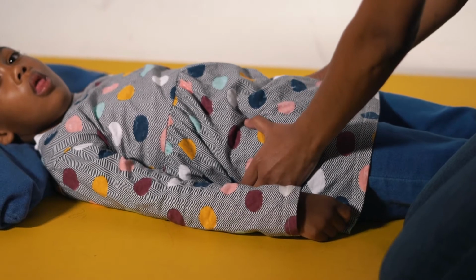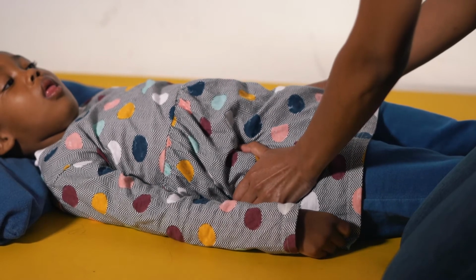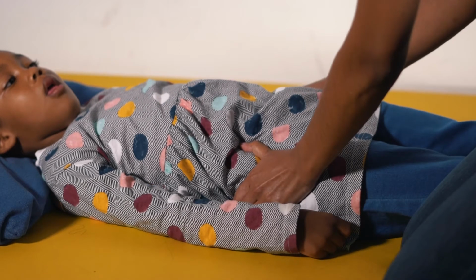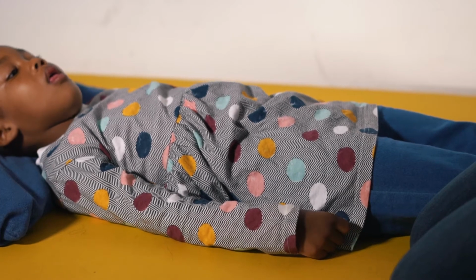To assess the rotation ranges of the pelvis, the therapist will move one side backwards while moving the opposite side forward. This will also be done both ways and will determine whether the client can achieve a neutral range or whether the cushion and relevant components will need to be modified.